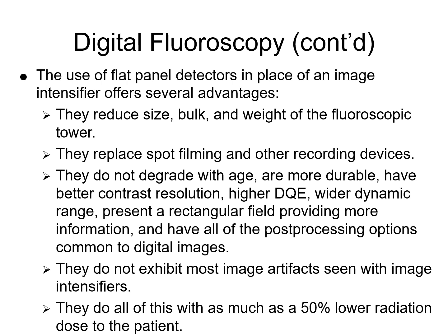We can do digital subtraction because that's a software package, that's a software correction. We can do all the post-exposure manipulation we can do with conventional digital images. We can also do this with digital fluoroscopy too. Usually what it is, you pause the run and then you make the change to one frame of the run.